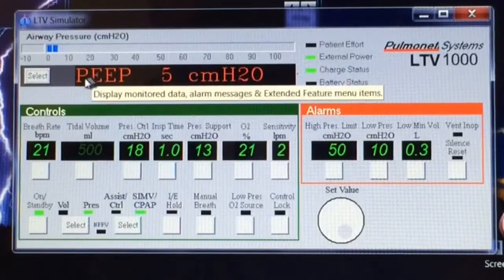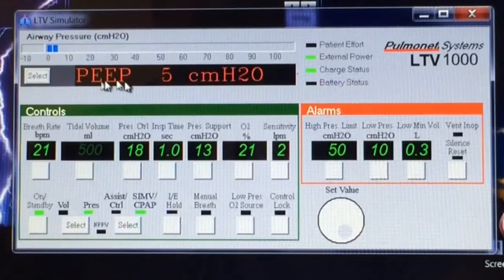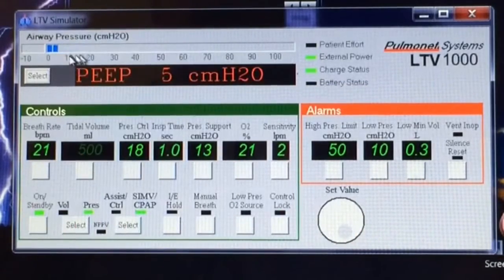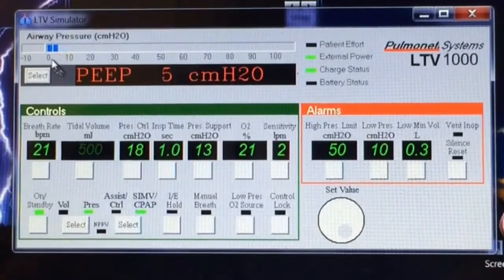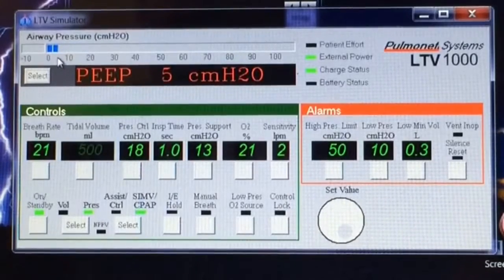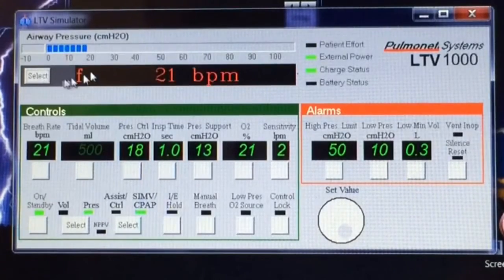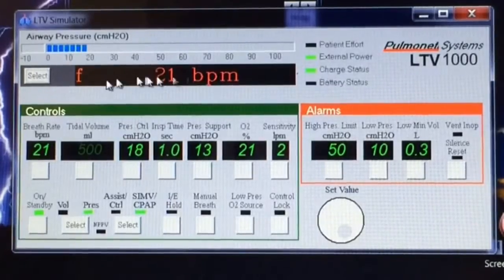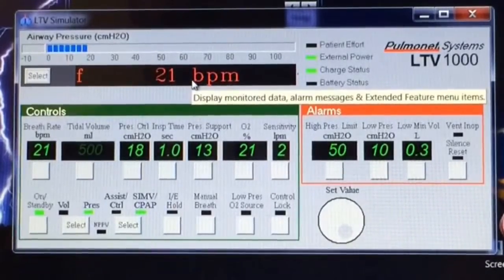The PEEP stands for positive end expiratory pressure — that's the pressure left on their lungs after they breathe out. You see here it doesn't go all the way to zero, it stops here about five. I'll explain the PEEP in a little more depth in another video. Okay, that's all the return patient values in here. Thank you so much for watching. Bye-bye.